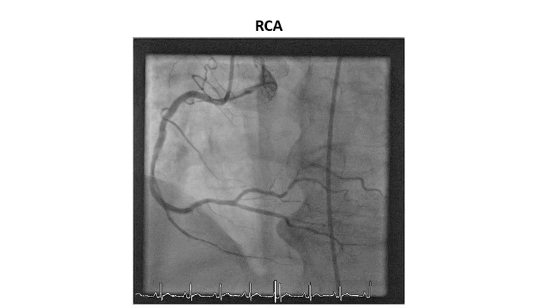We started off with the left ventricle. We went to the right side of the heart. We then started looking at coronary arteries. You saw moving images and stills of the left coronary artery. The other coronary artery to the heart is the right coronary artery. It's a simpler vessel. You notice it arises on the left side of the screen, which is the patient's right, whereas the previous shots of the left coronary artery arose on the right side of the screen, which is the patient's left. Hence, left coronary artery, right coronary artery.